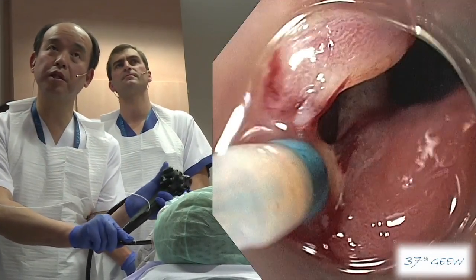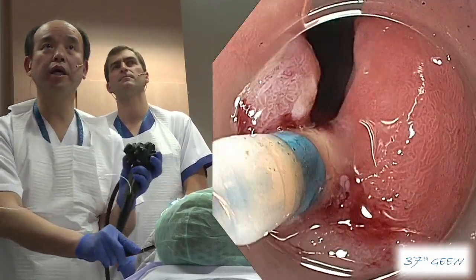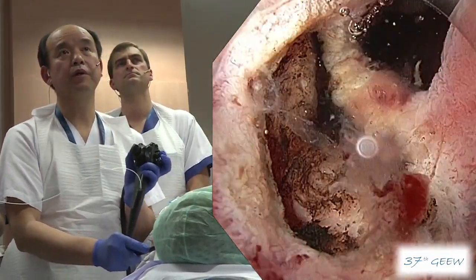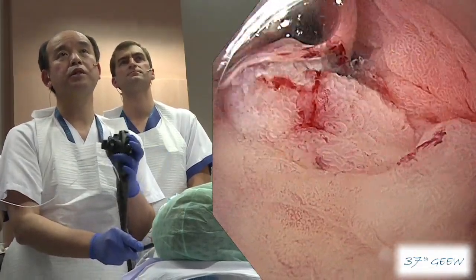Now I am using down-angle maximally. Let me check the incision line — it's perfect. Now we can see the muscle layer of the pyloric ring. It's enough depth.